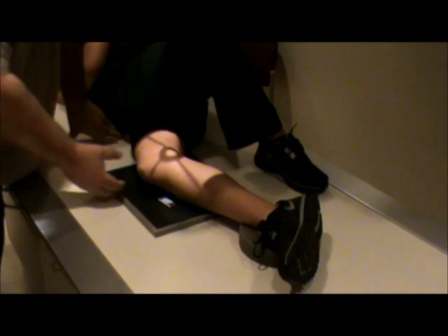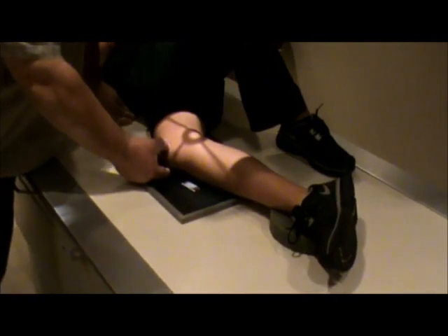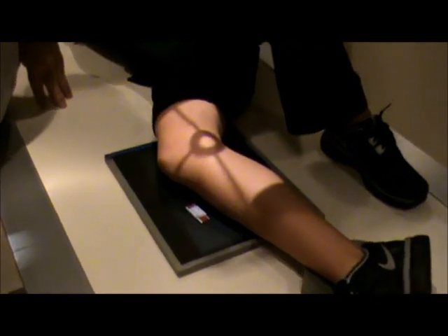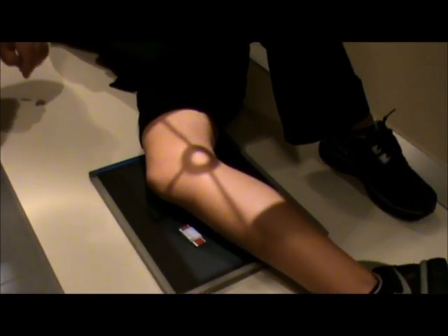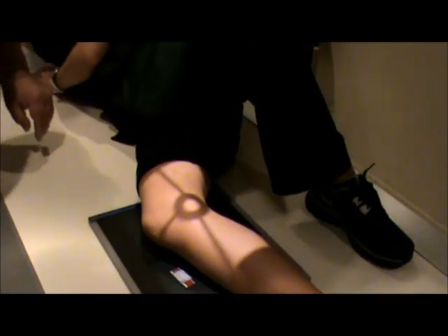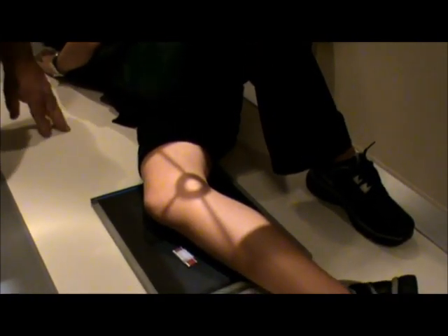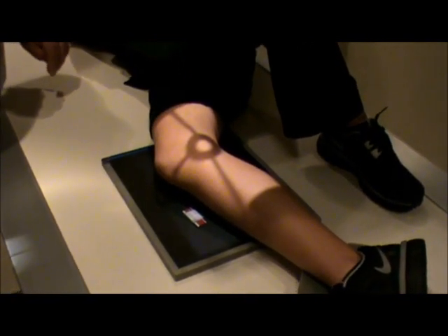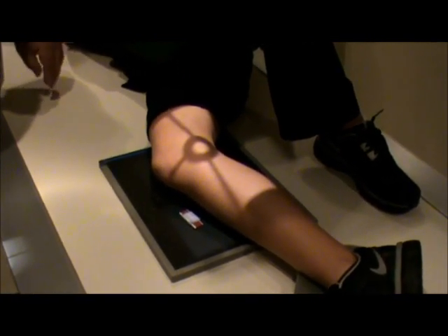The sponge is more comfortable for the patient and does keep it in a true lateral position, similar to what we do when we do the hip. This is our lateral knee view. Technical factors remain the same — 10 mAs at 60 kV. If you're doing it in the bucky, it will be 70 kV center cell. And these are our knee views.